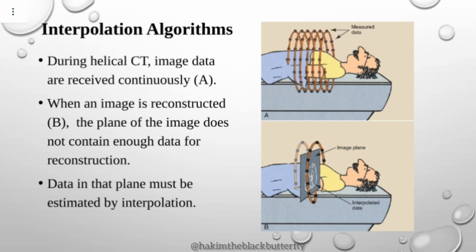So during helical CT, image data are received continuously. During helical, the tube and the detector are moving continuously, and the patient is also moving continuously through the bore. The data is received continuously.